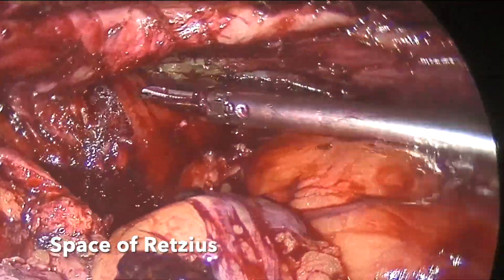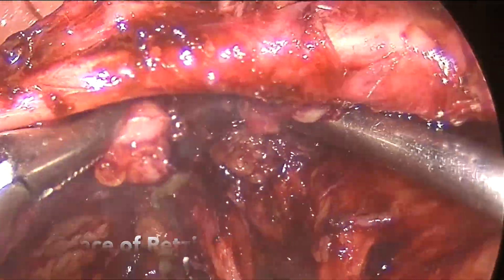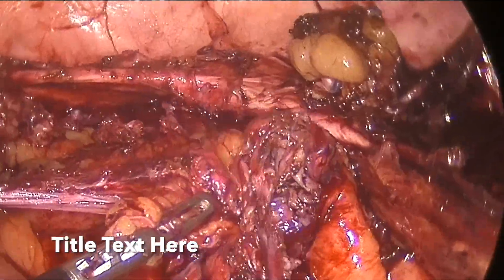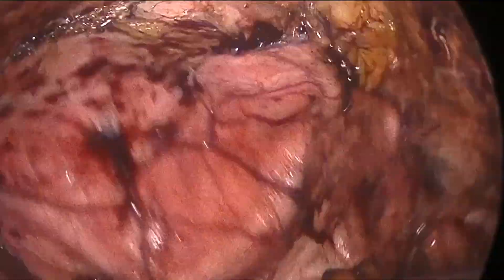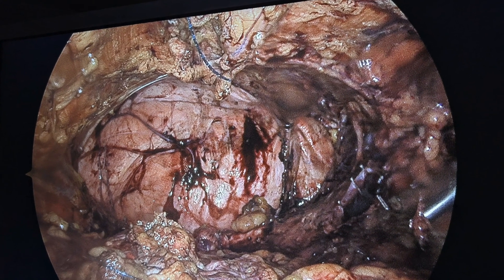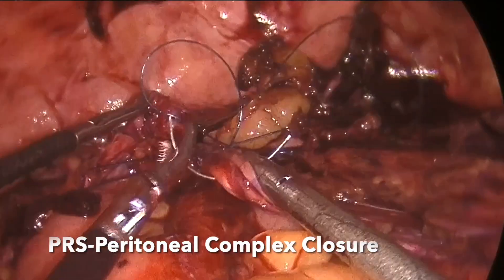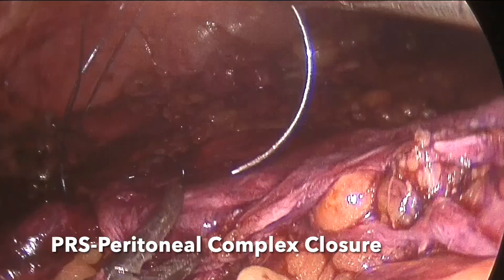Here, we performed the dissection by a laparoscopic approach to visualize the space of Retzius. As the bladder was densely adherent there, the bladder was distended with normal saline and methylene blue. We found that a robotic approach during the initial learning curve might be dangerous in this setting. So we shifted to a laparoscopic approach when the bladder was densely adherent to the previous scar.